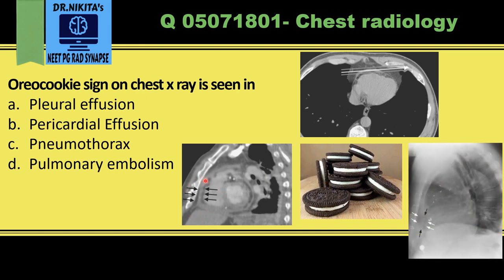On this chest radiograph, the same pattern is visible: the outer black line is pericardial fat, the inner black line is epicardial fat, and the white line in between is the pericardial effusion. So the Oreo cookie sign is seen in pericardial effusion.